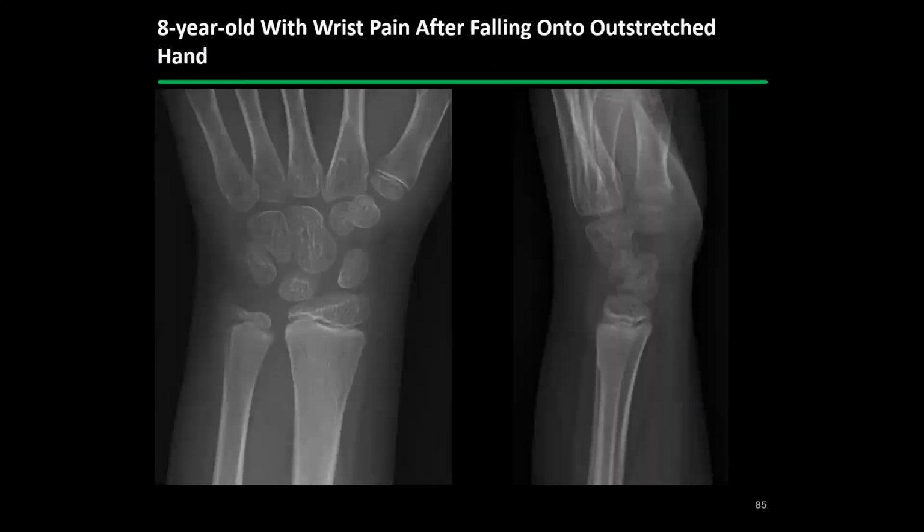This is a different kid, an older kid. They fell on an outstretched hand. As we were talking about having our nice smooth cortex, if we look at our ulna, this cortex is nice and smooth. If we look at our radius, it makes this little dip here where it makes a little buckle. And then if we look on our lateral in particular, you see this little sharp contour deformity along the posterior radius. So this is what's called a buckle fracture. They're very common in kids.